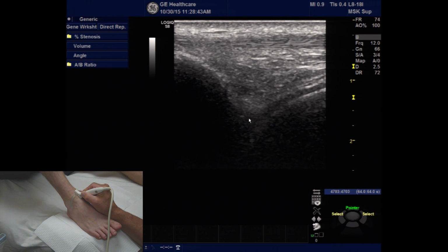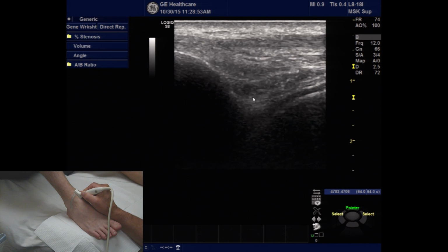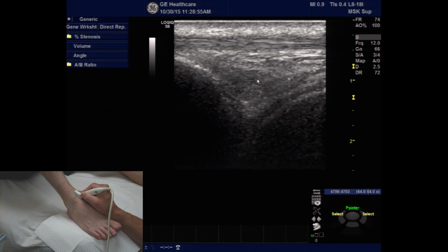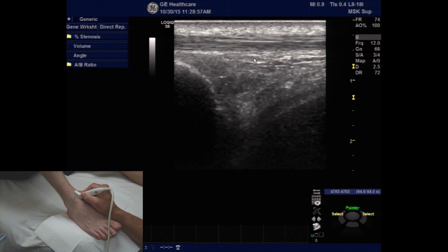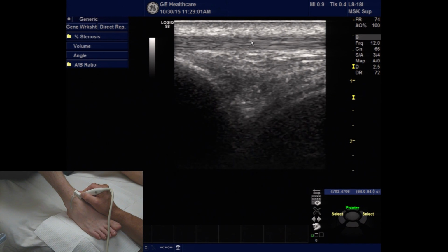So fluid in this situation would be accumulating in this deep area of the joint space and would displace the fat pad proximally, or superior, towards the transducer itself. And again, sitting just superior to that, you'll see the fibers of the tibialis anterior.